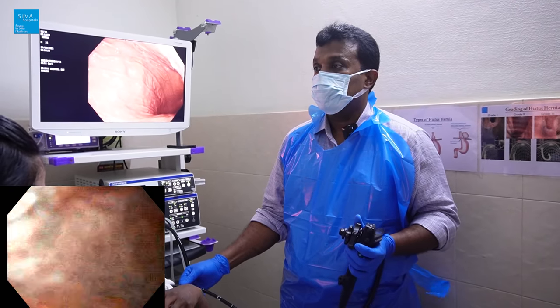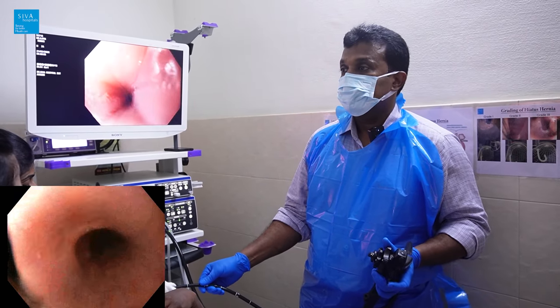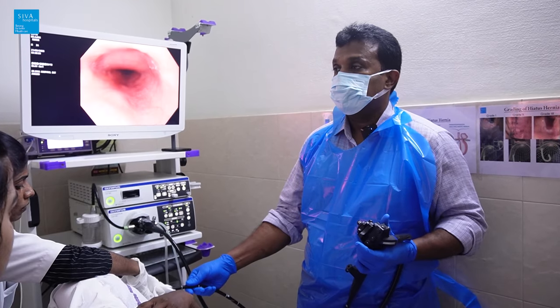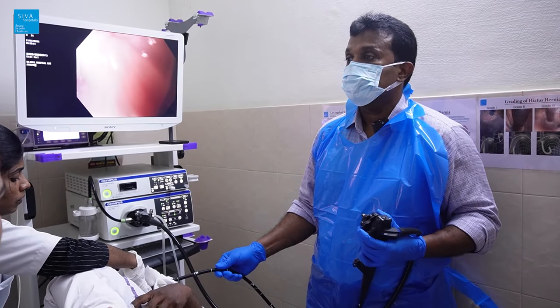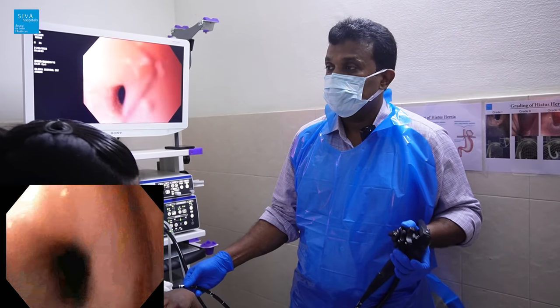As we come out, we deflate the stomach. Now looking at the esophagus again on withdrawal — you can see something that was missed earlier.